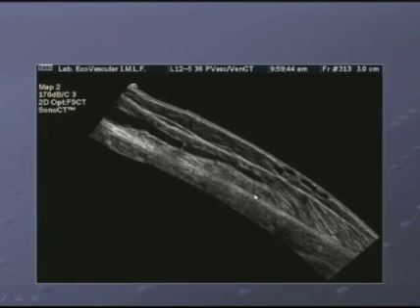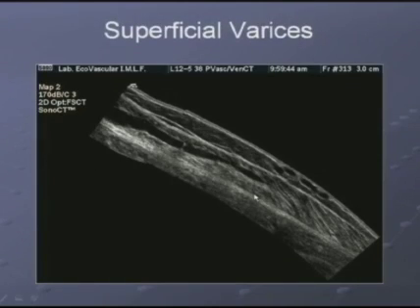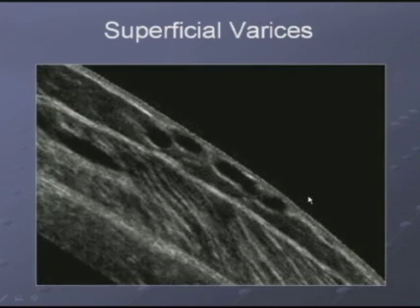Superficial vessels can also be observed by using this technique. In this patient, here we can observe the gastrocnemius vein, and we can observe here very superficial varices.